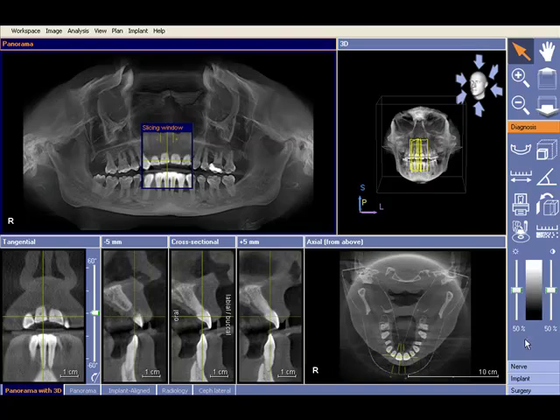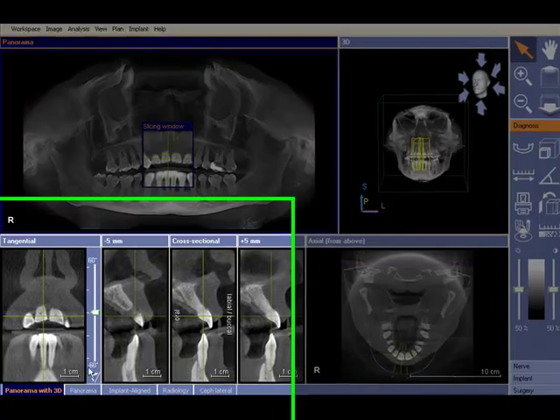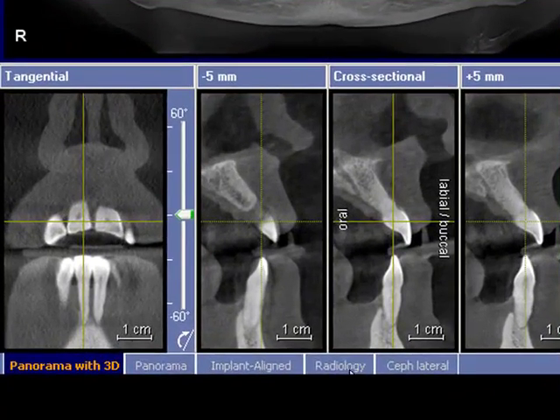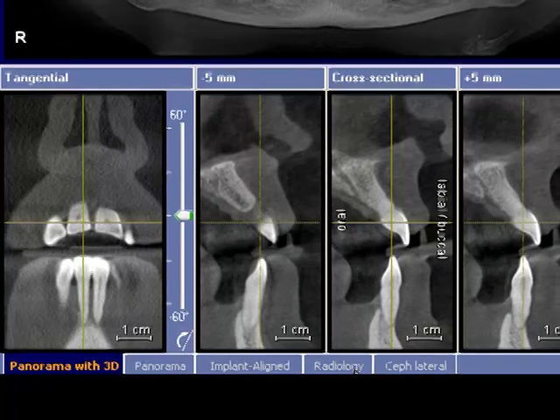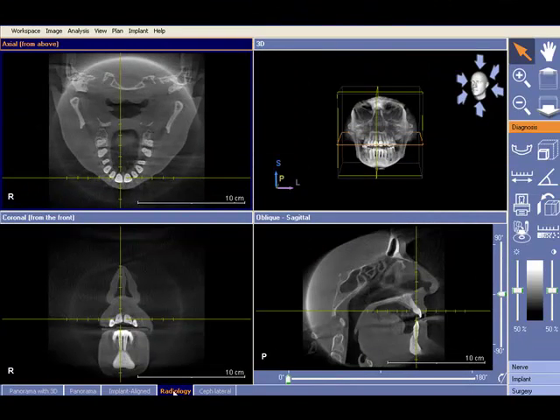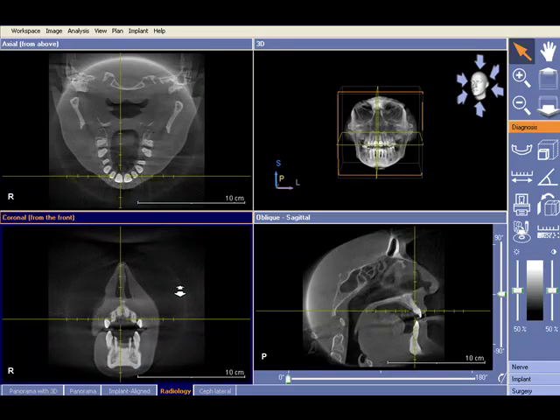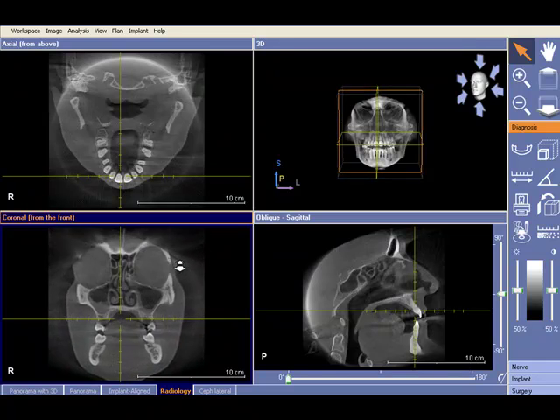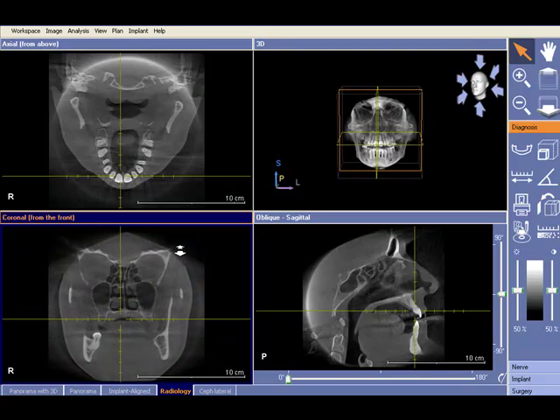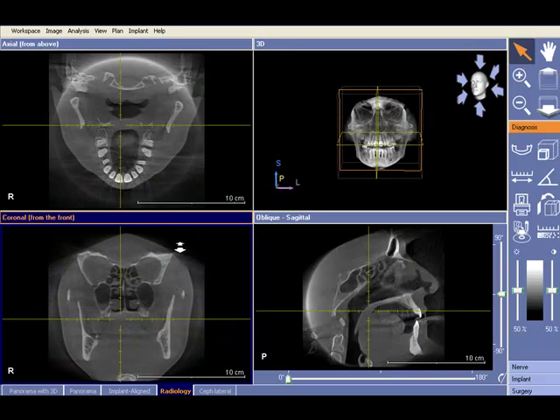Heading into the radiology tab just down the bottom here, left mouse click once. You'll be able to apply the same theory here in any of these windows. Just click on the window and left mouse click and hold — you've got your two arrows pointing up and down, scrolling up and scrolling down.